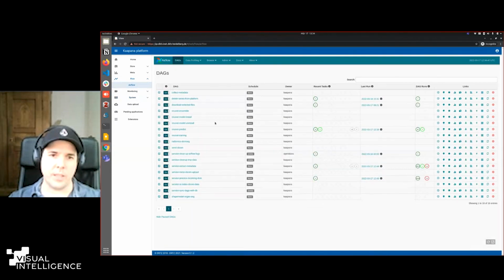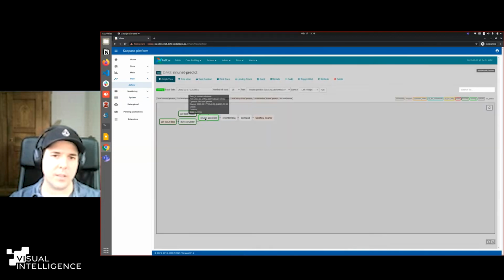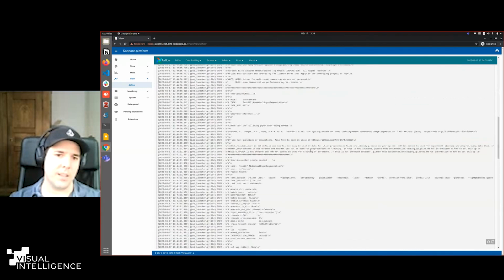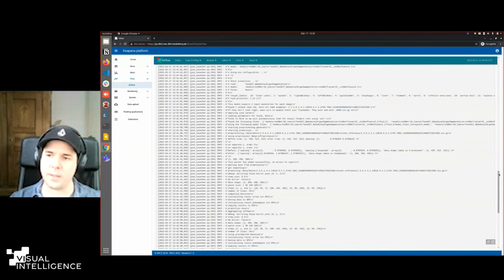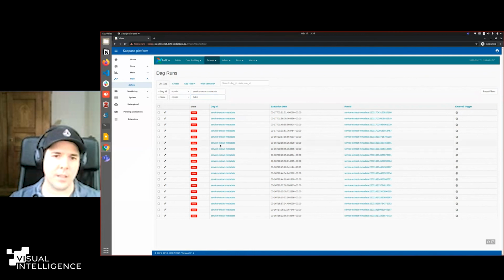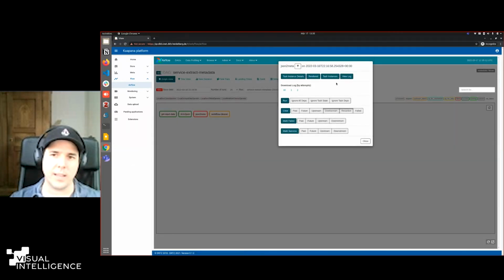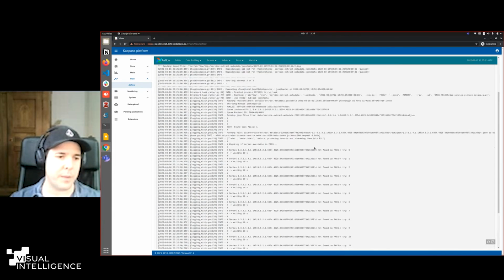But we can also do it from here. If we have a look at this view, we also see here is this nnU-Net inference container running, and we can click on view logs, and we see immediately what's going on in this processing step. That's also obviously valid if something goes wrong. Let me see, for example, here there was something going wrong. We can easily find out the pipeline execution which was not working, click on the step which didn't work, have a look at the logs, and maybe try to find some bugs.